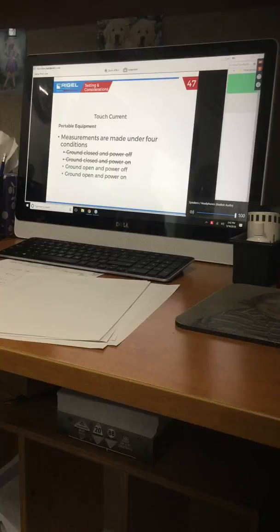talking about 2018, NFPA 99 2018. I had done a Google search. I did this presentation in California a bit ago, and we talked about conditions that you had to have to conduct the test. And at that point, I had Googled 2018 changes and saw changes in a number of chapters, but nothing in chapter 10. So my assumption was nothing had really changed all that much, but it has, and here's the change.